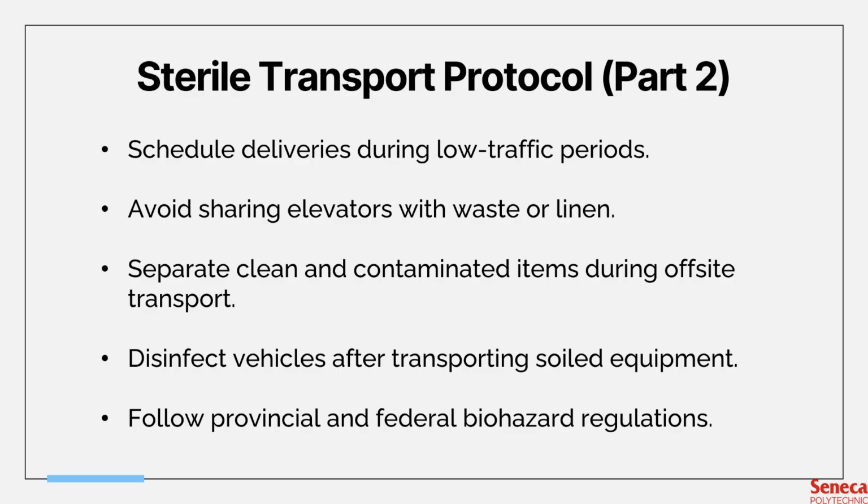During that time, we would probably put it against the wall in the distribution room or issuing area. We would put it there until a certain time when it's safe, especially for hospitals without any dedicated OR clean elevators. We would wait until the high foot traffic disappears and we would send it up maybe at 5 p.m. or 6 p.m. That's a good time. And like I said, avoid sharing elevators with waste, food, or even linen carts, as those carry contamination risks.